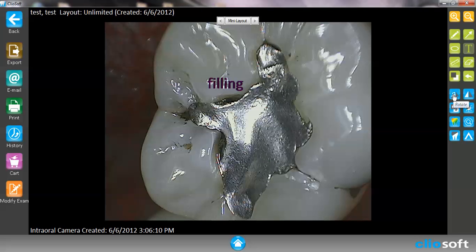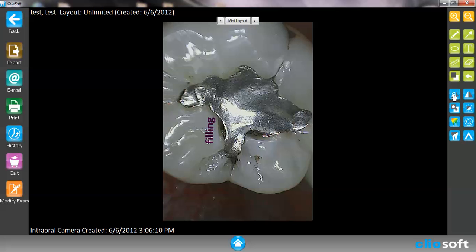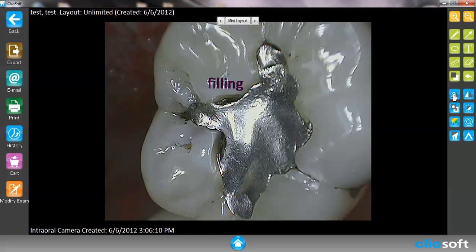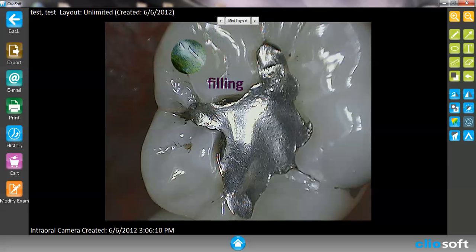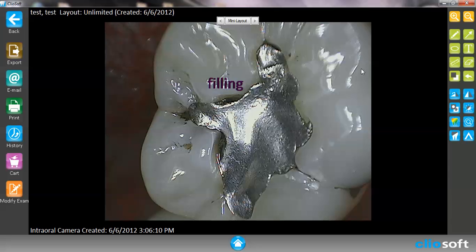We can flip the images around, and we can use the magnifying point to see where we would like. So these are just some of the options that we have to write and draw within the picture itself.